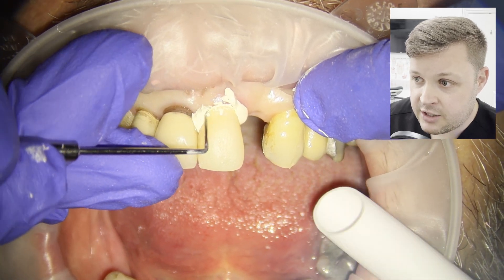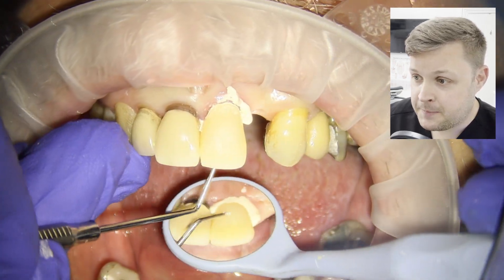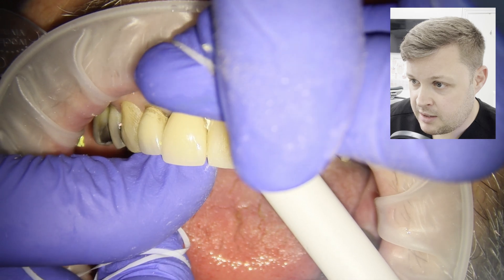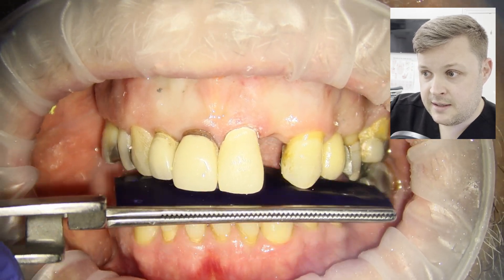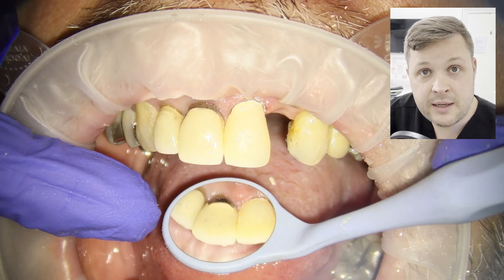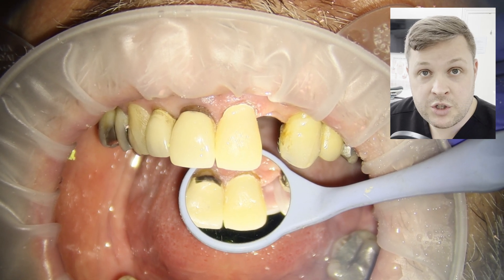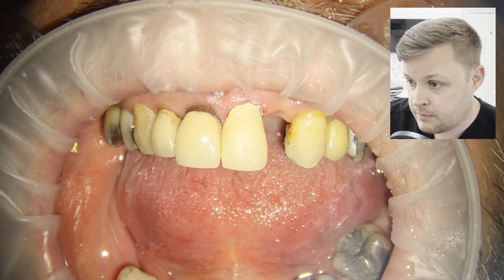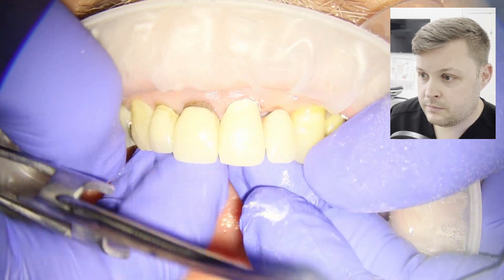Be super careful not to catch the gum, because we don't want it to bleed and we don't want to cause pain to the patient. After cementing the temporary, we check the occlusion, mainly because sometimes when you cement a temporary crown it can sit slightly proud, so the occlusion might be off.